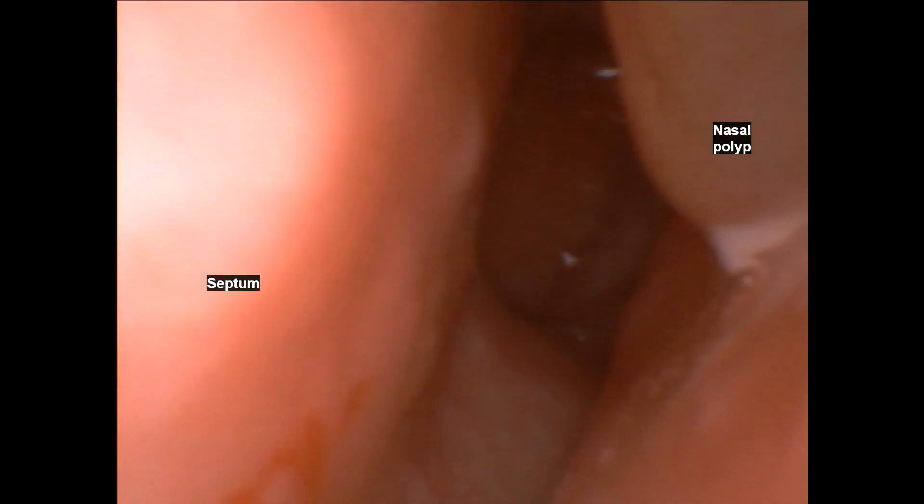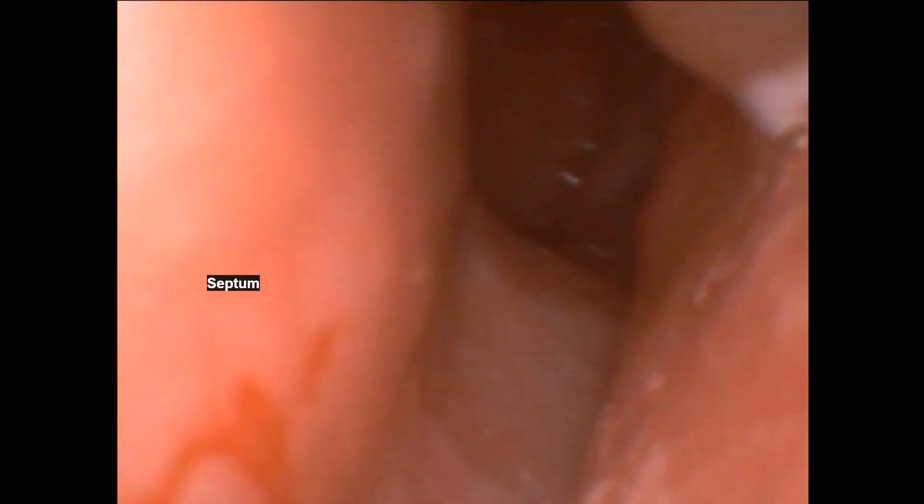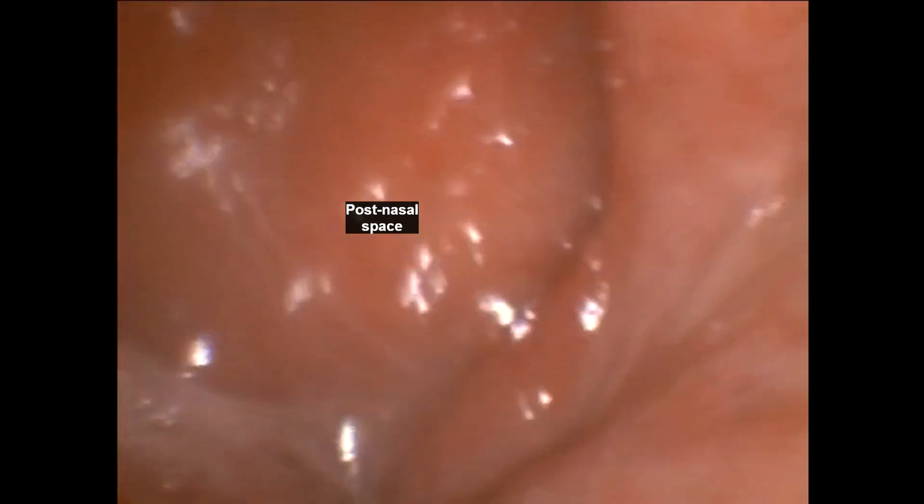I've prepared the patient's nose under local anaesthetic with lignocaine and phenylephrine, decongesting the nose and making it easier to pass the scope. This is an Amboscope branded bronchoscope, which has a working channel we can pass the instruments through.